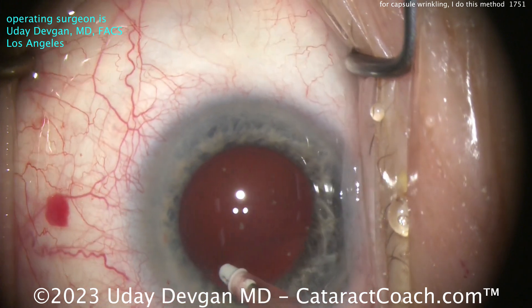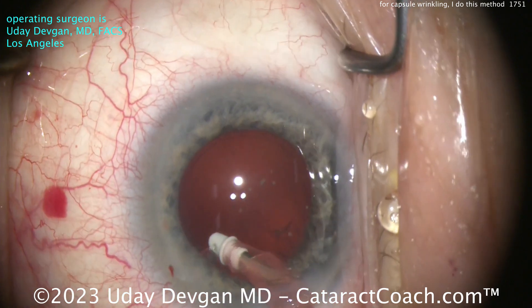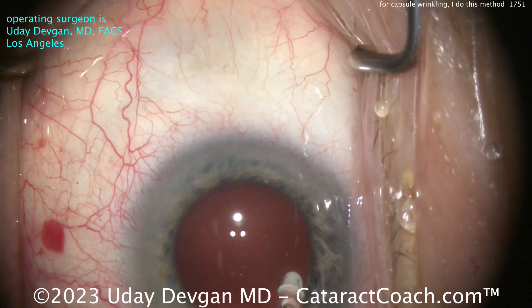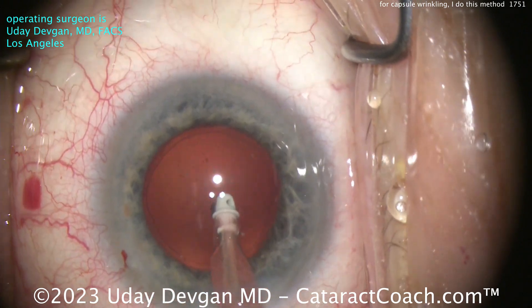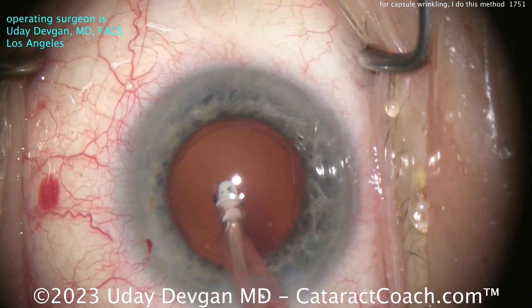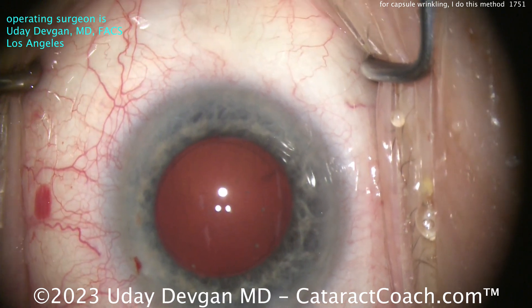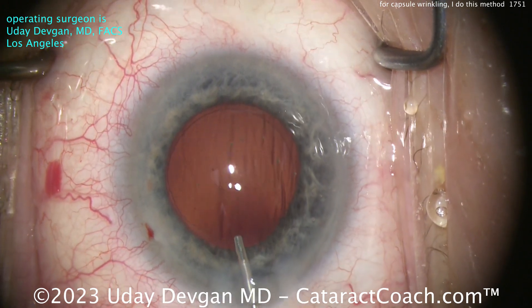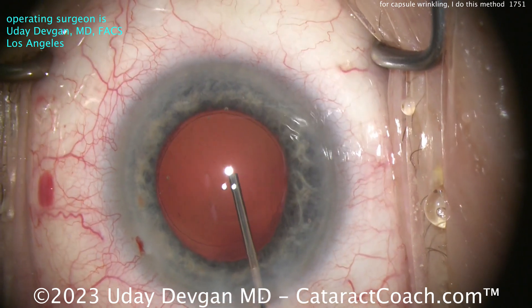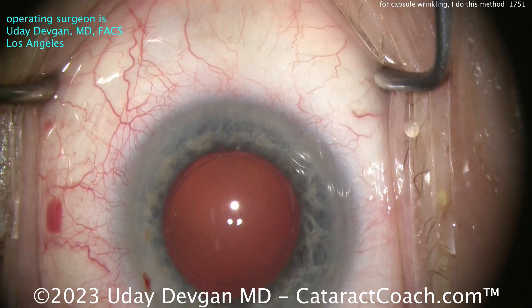Look behind the posterior capsule — you can see little pieces of lens material in the anterior hyaloid face. That's very typical in a case like this. Those are tiny little fragments that were small enough to go through the gaps in the zonular support. They'll be dissolved in the cascade of inflammation. You can see those tiny little particles — with cohesive viscoelastic filling up the capsular bag. They'll be gone within a few days, but will cause a little bit of extra inflammation, so be more cautious in the postoperative period.